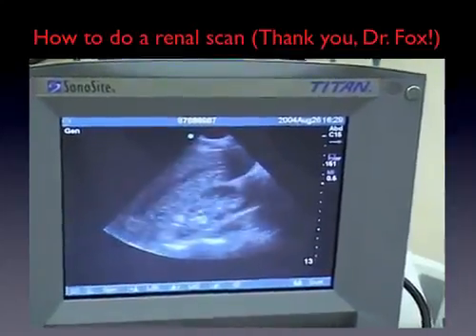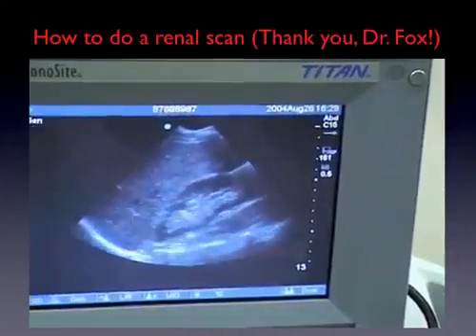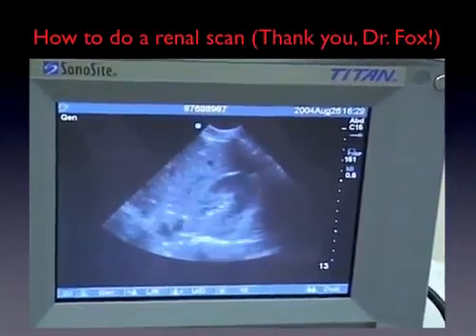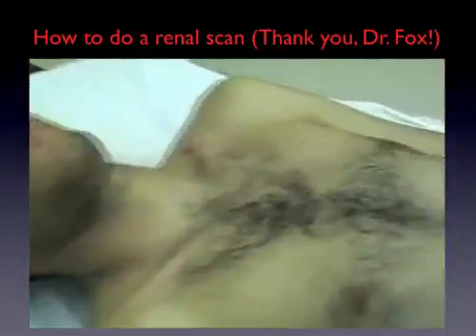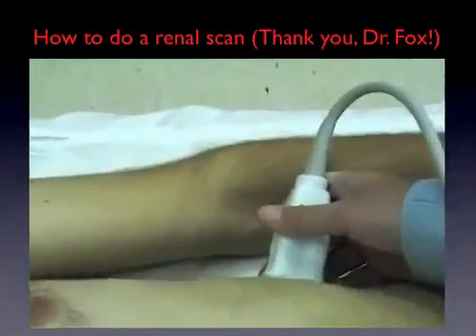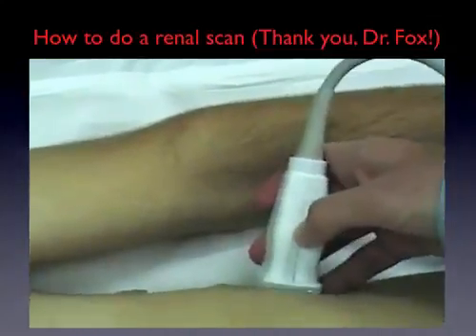I didn't mention that with the gallbladder, but you want to do that with the gallbladder too. You want to fan through the gallbladder's long and short axis. But that's the kidney's long axis. Rotate the probe 90 degrees, and there's a short axis. And again, on the left side, it's the same thing. Indicators towards the patient's head to get that long axis on the screen, and then to get a short axis, you rotate it towards the ceiling.